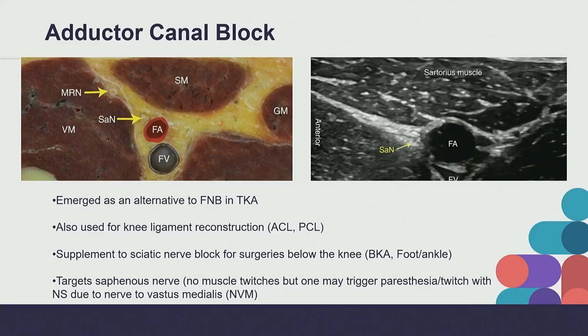It's also a great block for ligamentous injury and repair, especially if we're trying to get any of the cruciate ligaments. And it's a great supplement to the sciatic nerve, especially if we're doing foot and ankle procedures or below the knee amputations to predominantly get that saphenous nerve.